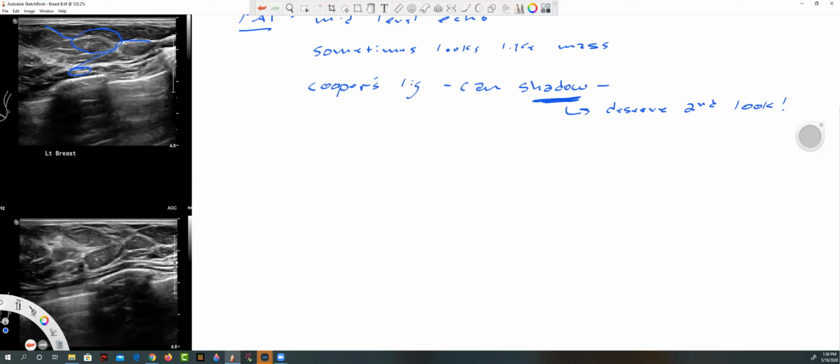A lot of implants are retromuscular, so they literally put it behind the pectoralis major muscle. Well, that makes everything just come out even more. So that's not a problem. But if the implant is on top, then yes, it could cause some difficulties. Not too much. And if they have an implant, then usually part of your job is to just quickly check the implant for any kind of leaks.